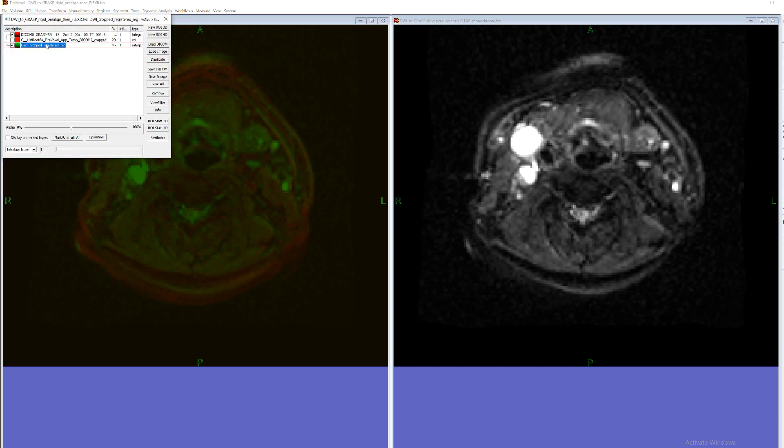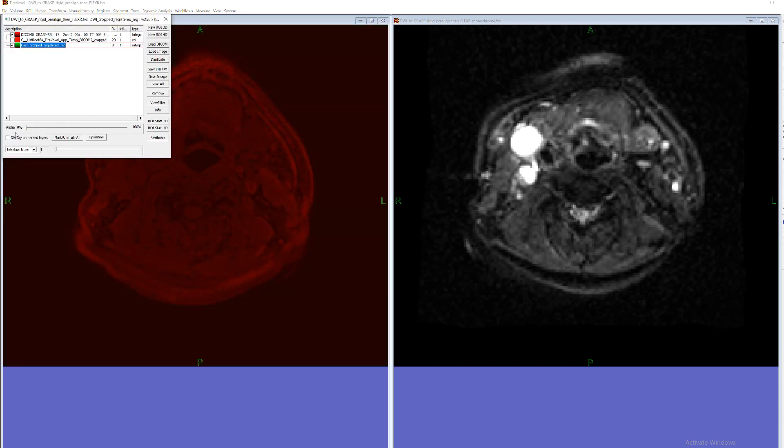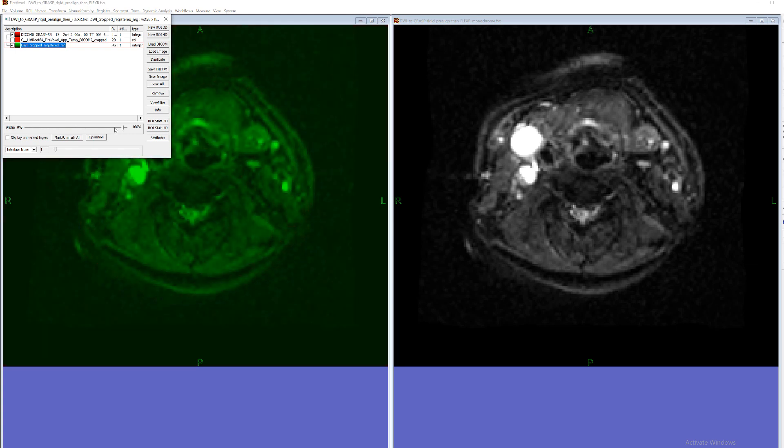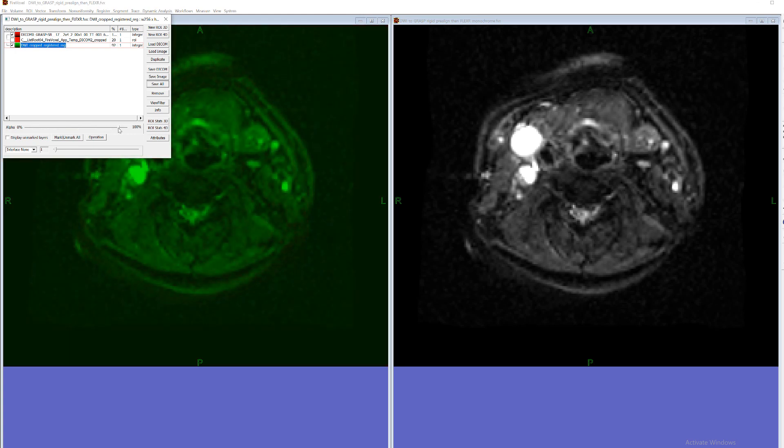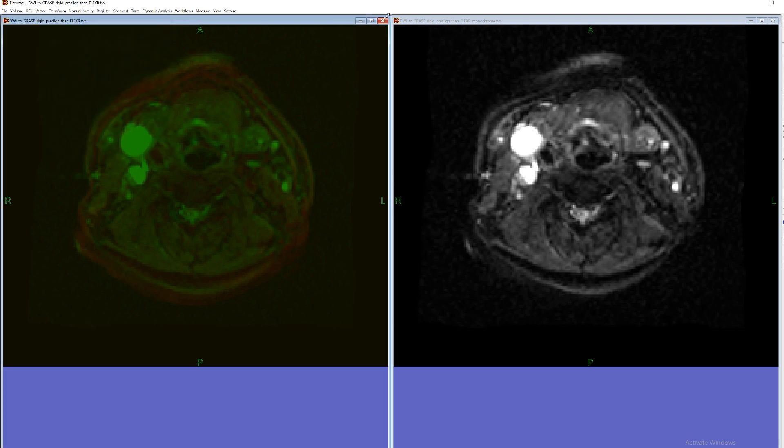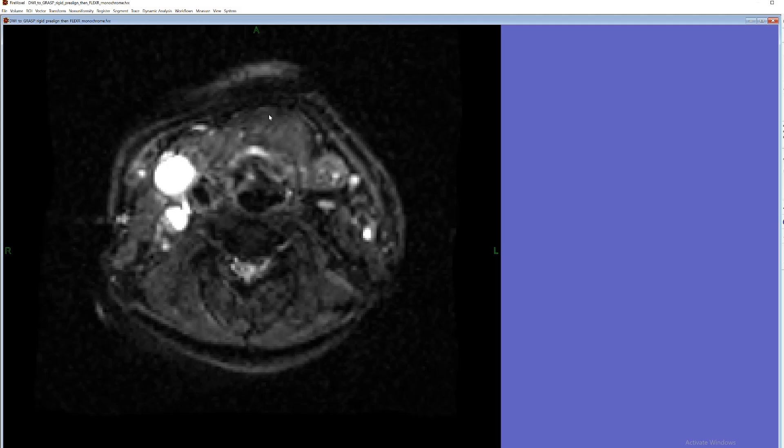And there is the standard way that we use when we overlay green over red. And then changing the intensity of the top layer, we could sort of see through and observe the alignment of different features.